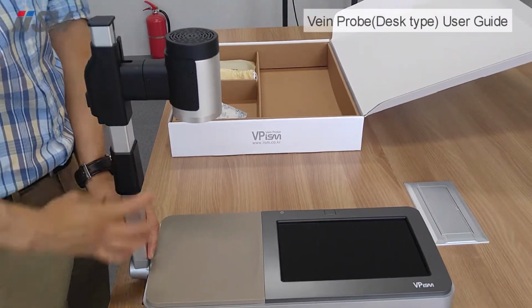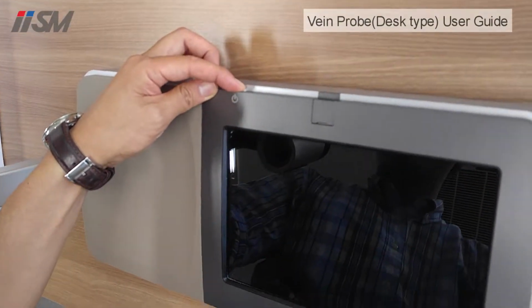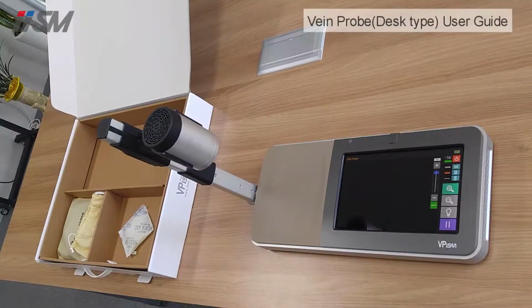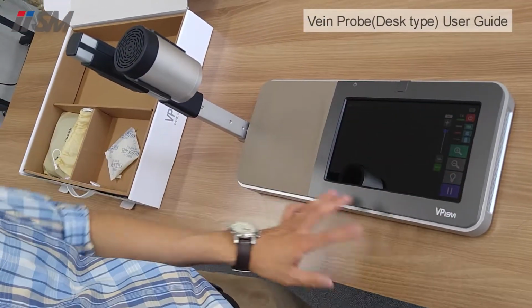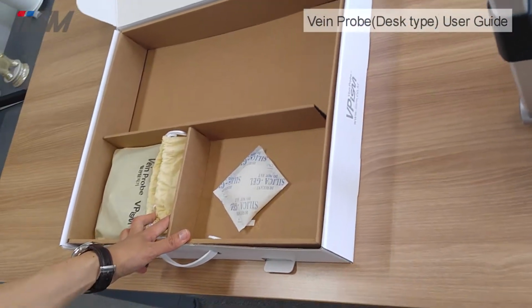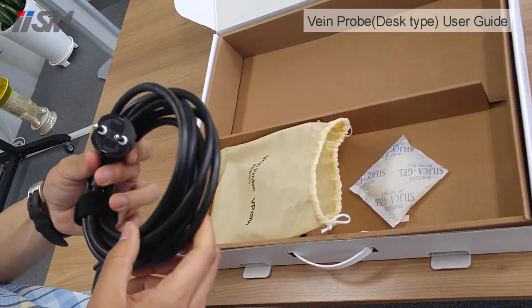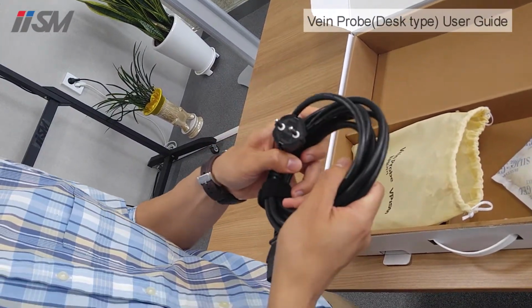Okay, so after making it stable, you turn on the device. Click on the power button for about 3 seconds, and you will see that it turns on, and you have to wait until it loads properly. After you turn on the device, you see now the program has loaded. When you install the device for the first time, the battery will be low, and that is why we have the power cord. So in the beginning, we recommend you charge the device fully using the power cord before using it without it.